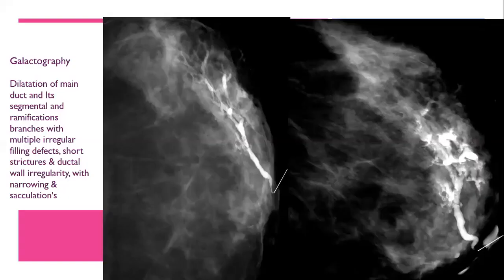Then, because of nipple discharge, we had done a galactography for her. This was a long time ago, before 2010.